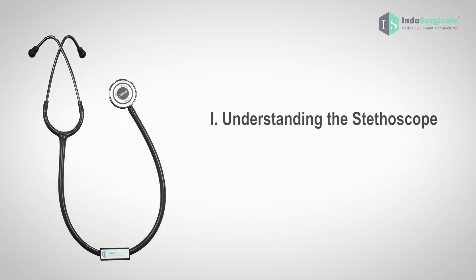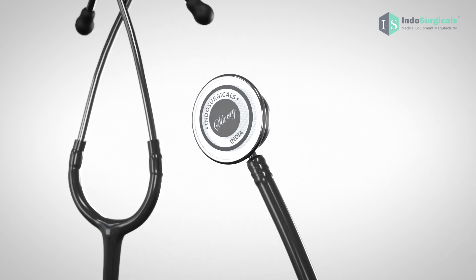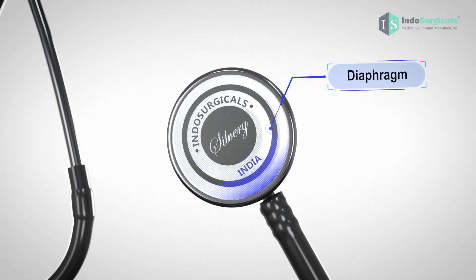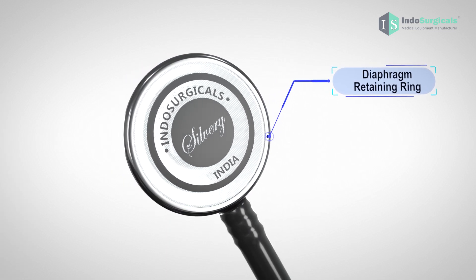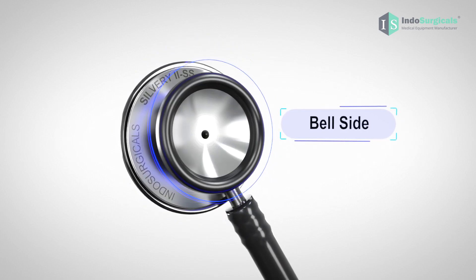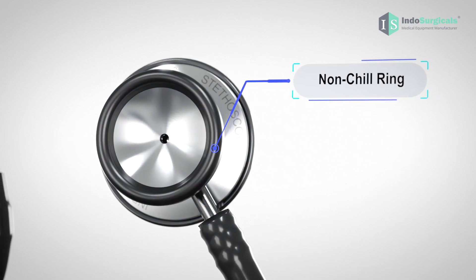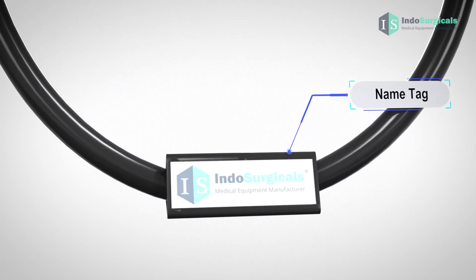Let's begin by familiarizing ourselves with the various components of the Indosurgical Silvery Stethoscope. This is the chest piece of the stethoscope. This is the diaphragm, and this is the diaphragm retaining ring that securely holds the diaphragm in place. This side of the chest piece is the diaphragm side, and the opposite side is the bell side. There is also a non-chill rim for patient comfort. This is the PVC tube, and this is the name tag.